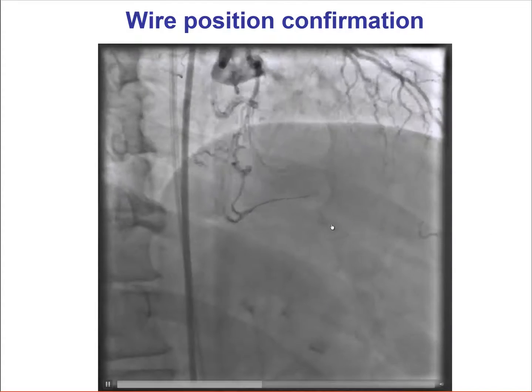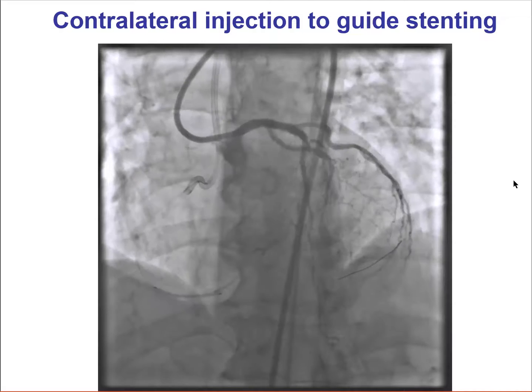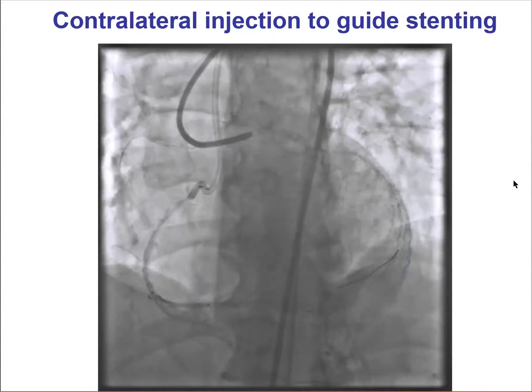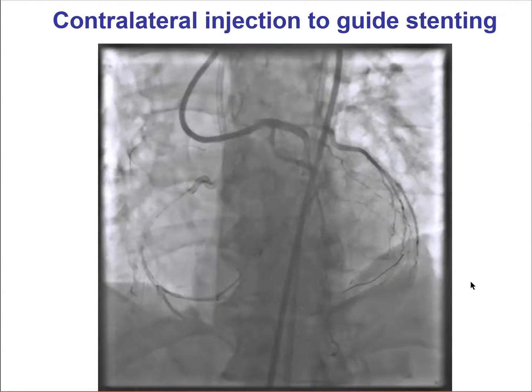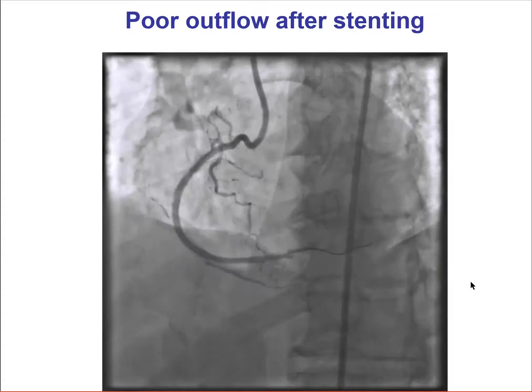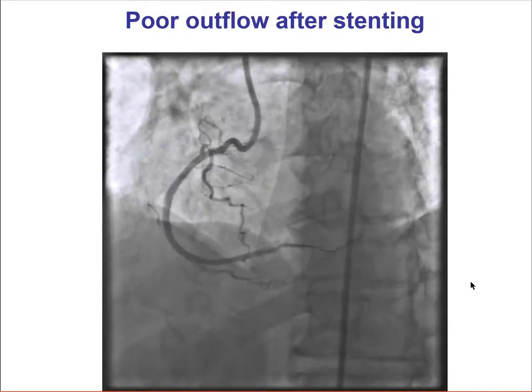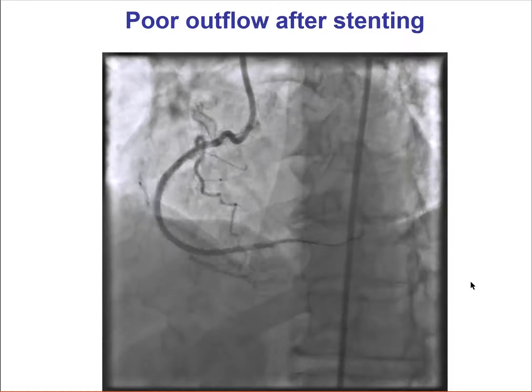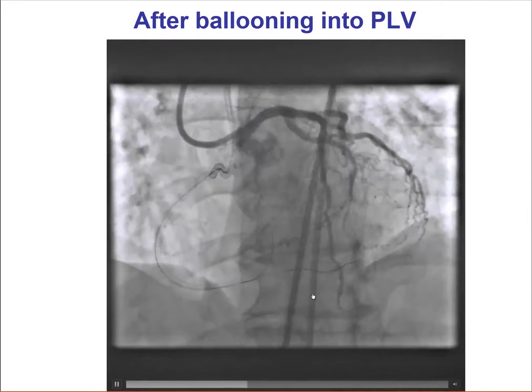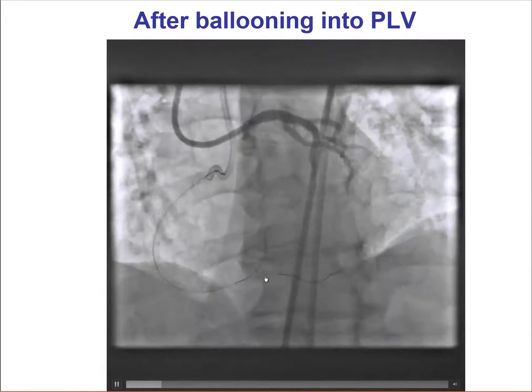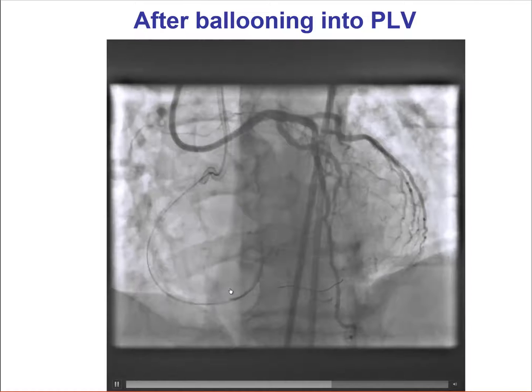An orthogonal projection confirms that the wire has entered the distal true lumen. We then placed stents using contralateral injection to guide the initial deployment location. After stenting the entire right coronary artery, we were surprised to see very limited distal outflow with occlusion of the right posterolateral vessel as well as the right PDA. We then tried to rewire into the PL and the PDA, and performed a small inflation with a 1.5 millimeter balloon.